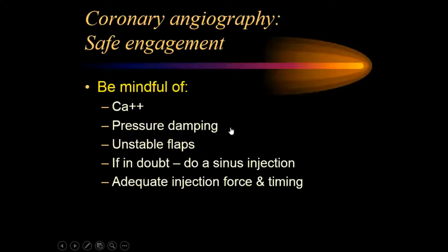Now, moving forward to engaging into the coronary arteries. So you've got your puncture right, you've gone in with a diagnostic catheter, and you want to engage into a coronary artery. Although people take it for granted, it can be serious and it can cause problems. I have seen throughout the years engagement going wrong, people going into VF arrest because of wrongful engagement, closure of vessels, dissection upon the initial injection, all sorts.